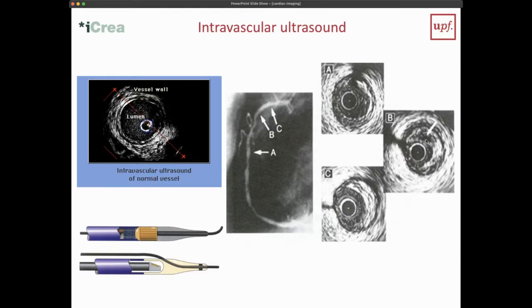We cannot pay this. Plus, although the information it gives is clinically more informative, because you see what's going on in this vessel, it doesn't hugely change the clinical decision making. Because we would mostly only treat the vessel with stents when it's clearly visible on the angiography, because it doesn't help the patient in the long term if we do it earlier. So although it is a very nice imaging modality to look at details, it's only used in pathophysiology research, when we really need to know these details in order to understand something for a new drug or a new type of stent or something like that.